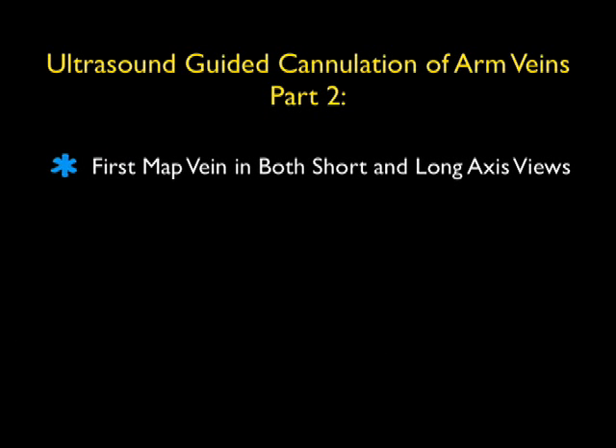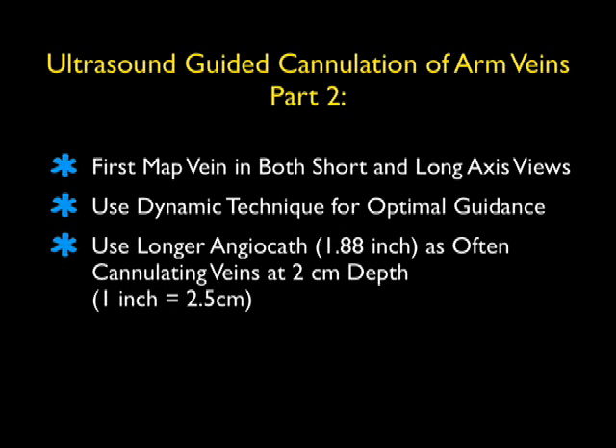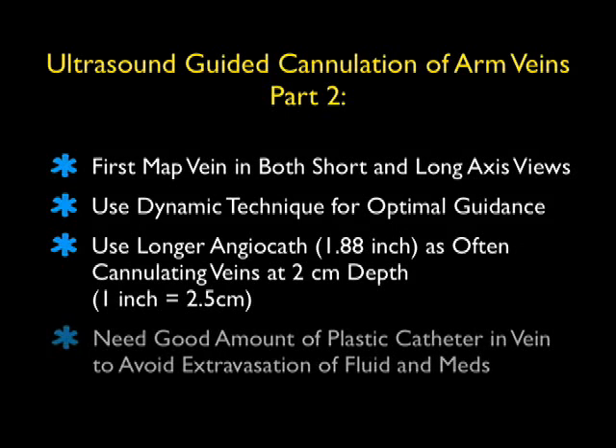Today's module is Part 2 of Ultrasound Guided Cannulation of Arm Veins. As we discussed in module one, we'll first want to map out the vein in both short and long axis views to best determine the anatomy prior to a puncture attempt. We'll be using a dynamic technique, or real-time guidance, for optimal guidance of the needle tip into the vein lumen. We'll want to use a longer angiocath — usually about a 1.88 inch angiocath — as we're often cannulating veins down at about the 2 centimeter depth. For those who didn't grow up with the metric system, 1 inch is equivalent to 2.5 centimeters. We need to have a good amount of the plastic catheter in the vein to avoid extravasation of fluids and medications.